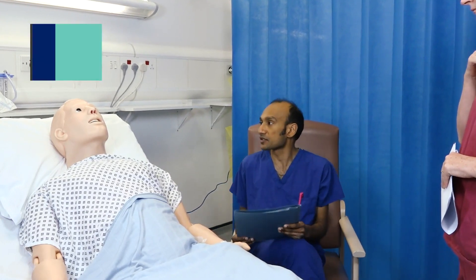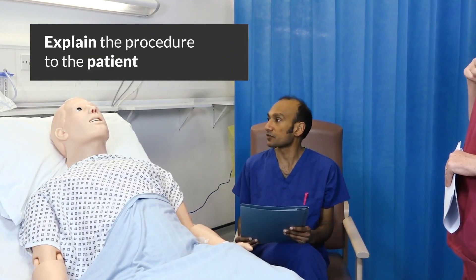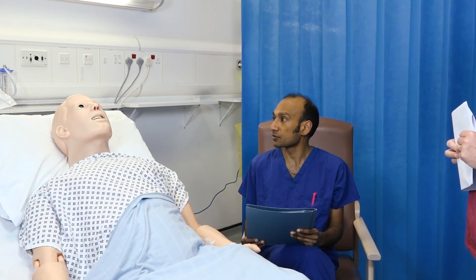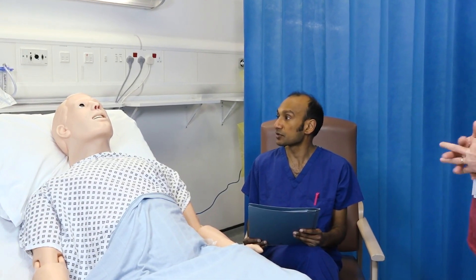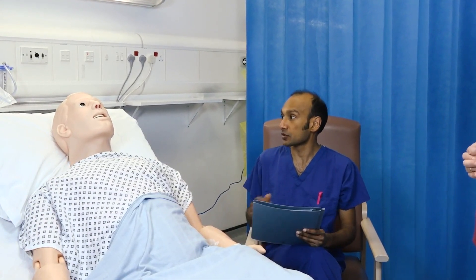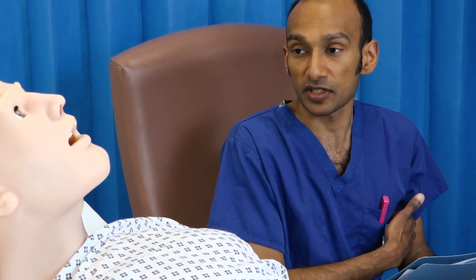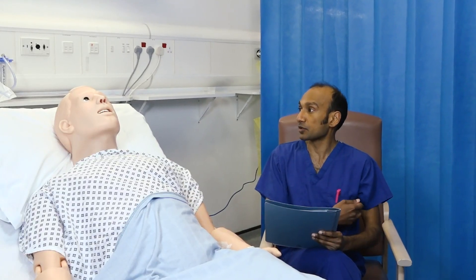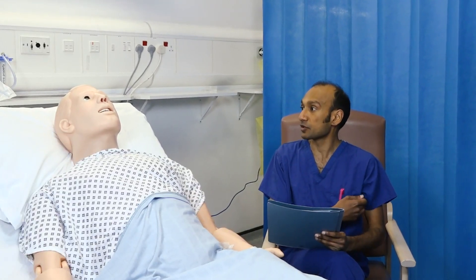Where possible, explain the procedure to the patient. If the patient lacks capacity, a decision must be made on best interest, as per the Mental Capacity Act.